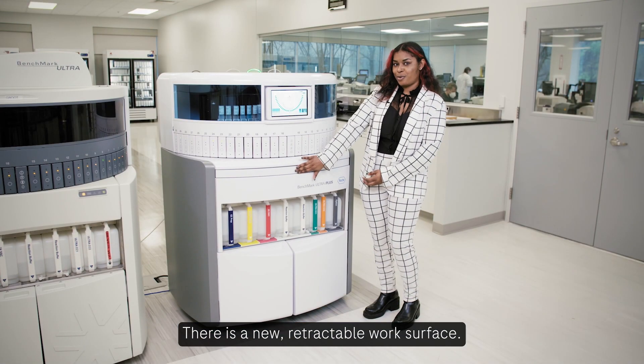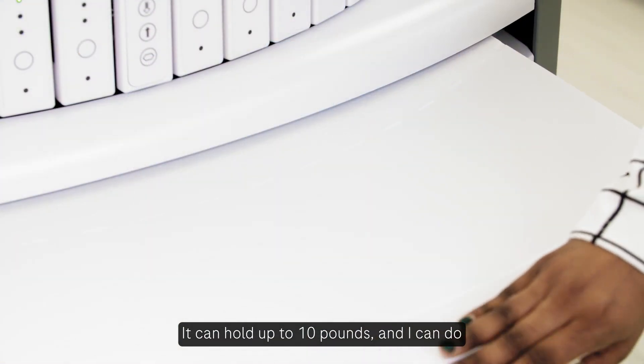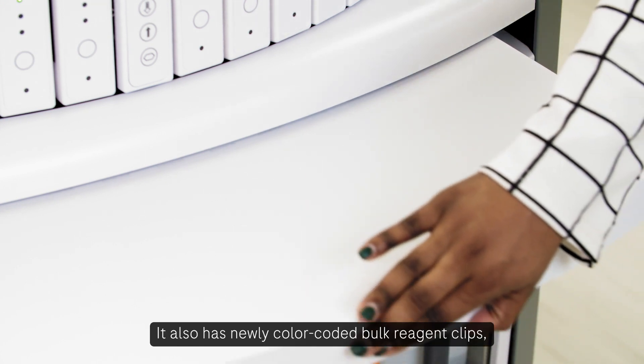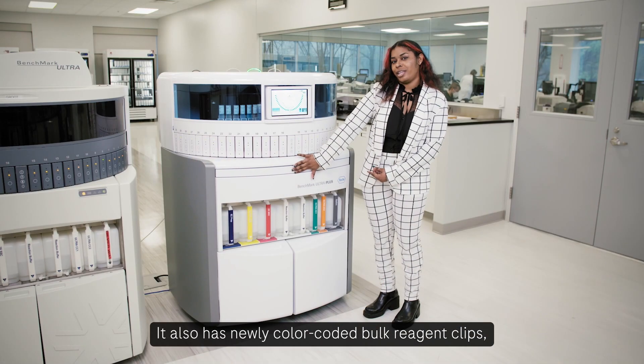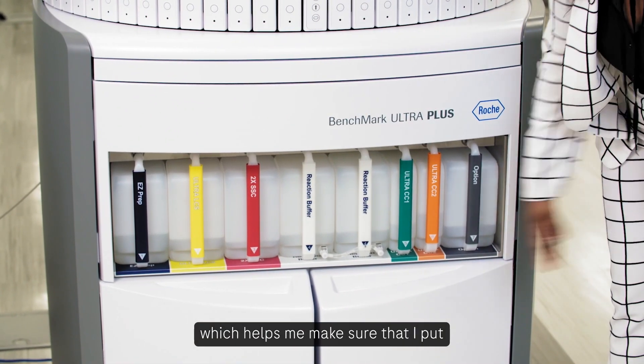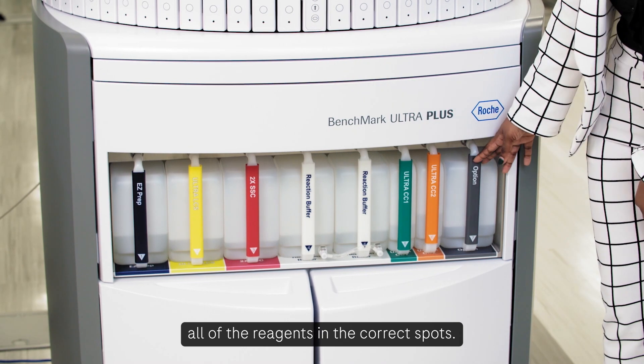There is a new retractable work surface that can hold up to 10 pounds, and I can do pretty much anything on here when I need to. It also has newly color-coded bulk reagent clips which help me make sure that I put all of the reagents in the correct spots.